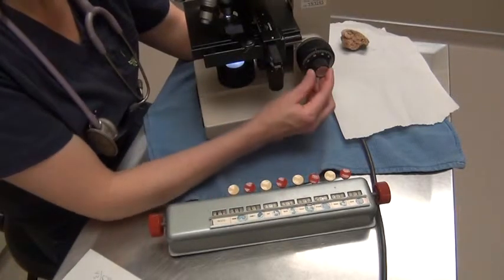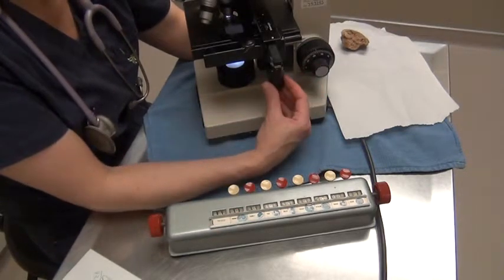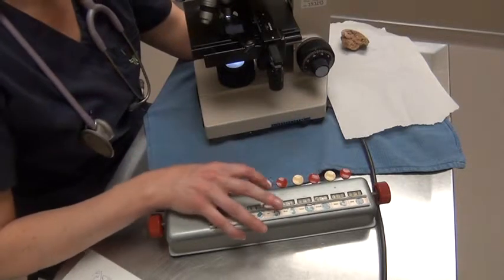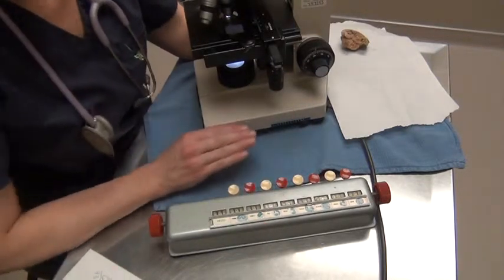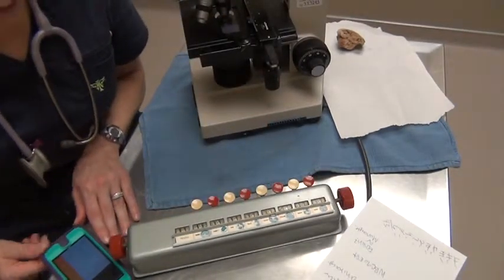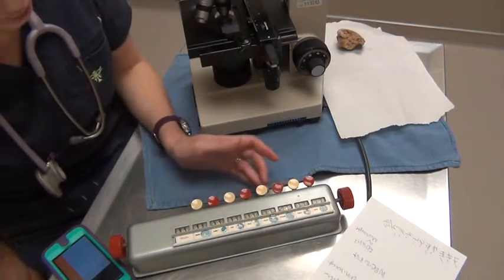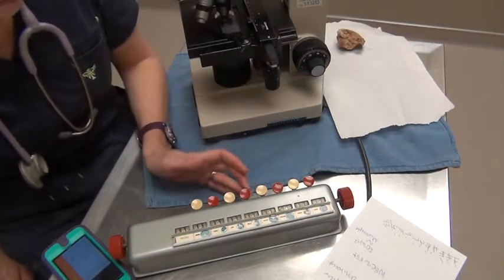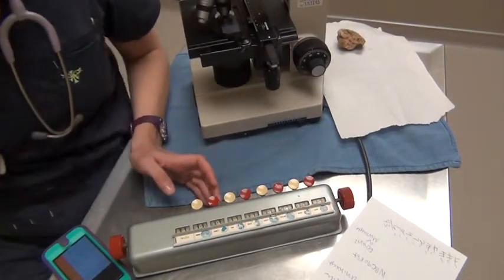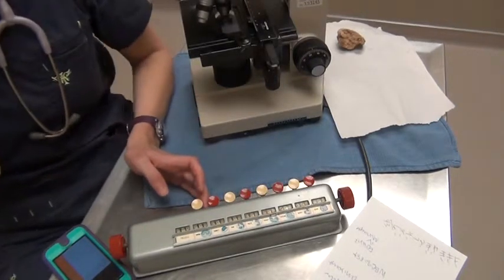Alright, and after we reach 100, we're going to go ahead and give you the percentage of the white cells that I found. Like I said, it's predominantly neutrophils. Okay, we're going to go ahead and discuss our findings. We have 5% eosinophils. We've got 2% bands, which are unusual to see. We've got 62% neutrophils. We have 15% lymphocytes and 16% monocytes for a total of 100%.